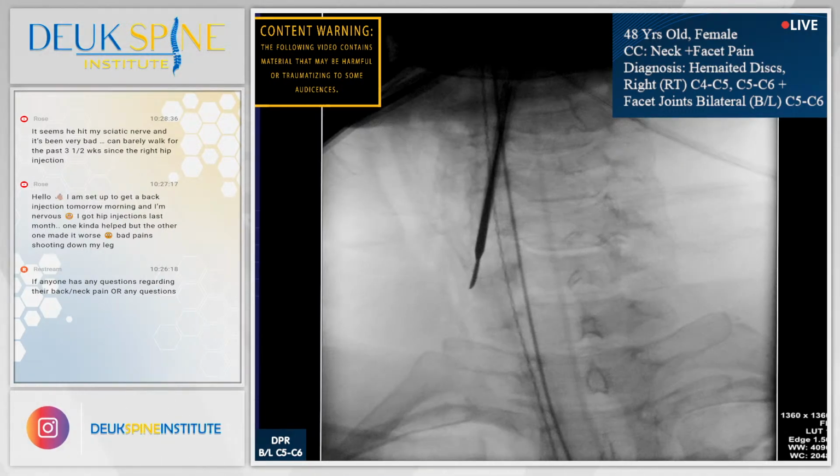The problem is, of course, that in a lot of patients, the nerve is not exactly where they put the probe because the nerves are kind of thick. They're thicker than the probe. In many cases, I just felt the nerve right there.